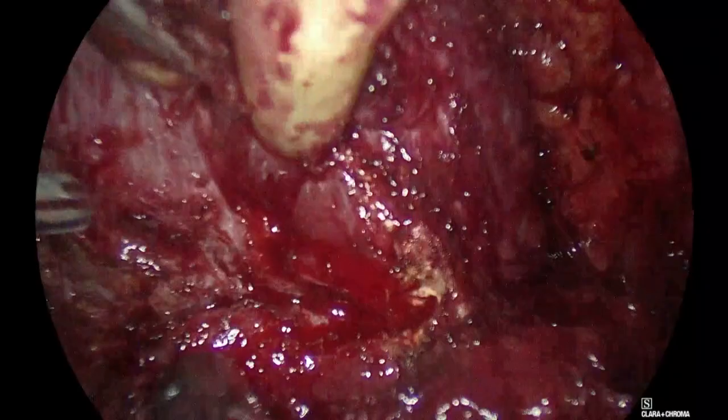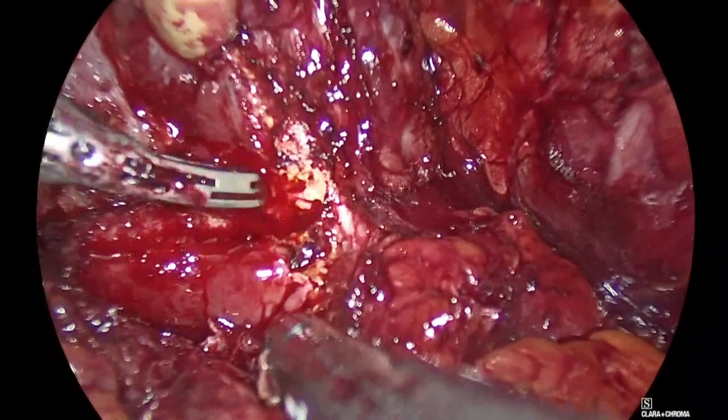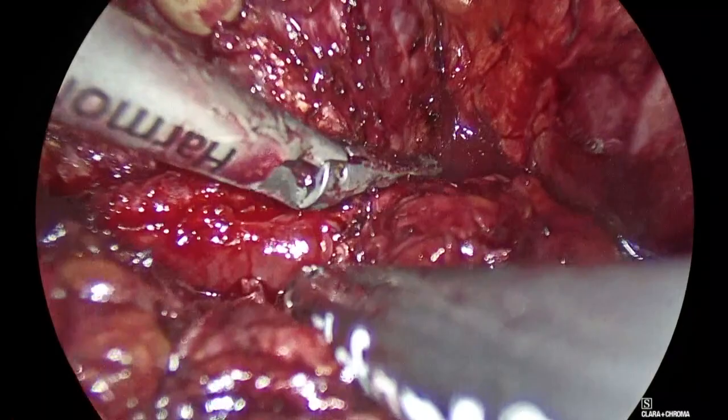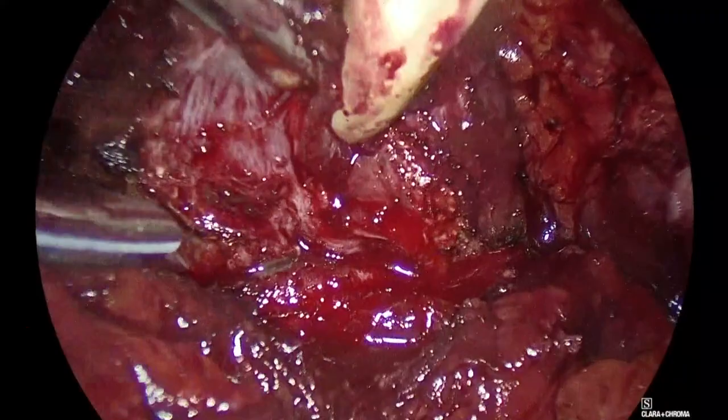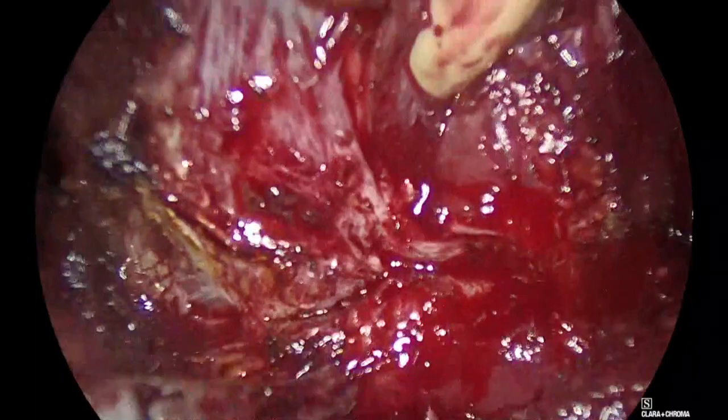Good, so you see here again, look, bladder ends here. If you cut like this, you go in the bladder. So you need to start cutting here, go deep, but rotate your harmonic towards the prostate. Okay? Good. Good, central. Central, good. Suction here, good. Put the bladder down.